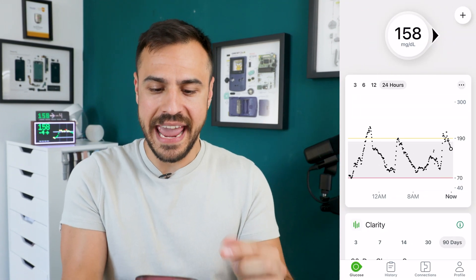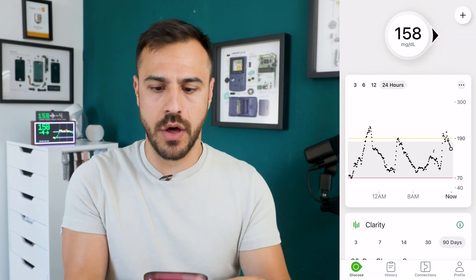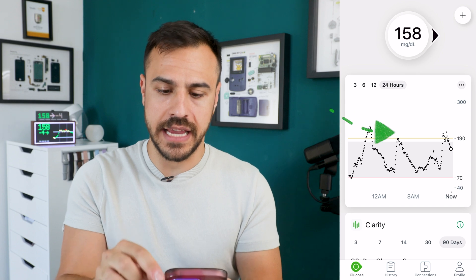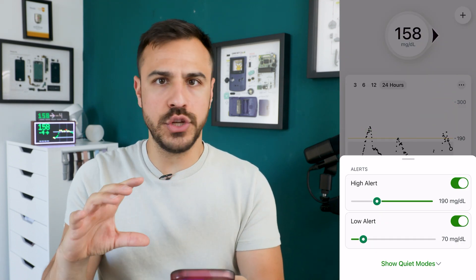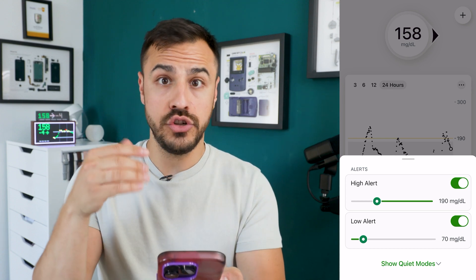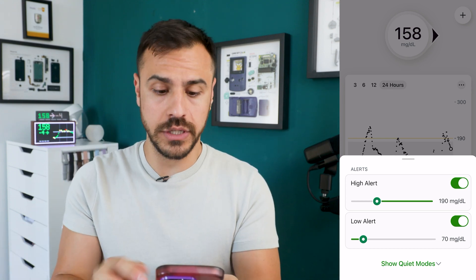I want to start with the first thing you're going to see, which is the home screen. Near the graph of all the readings, there is an ellipsis in the top right corner. Just tap on that, and this gives you instant functions and the ability to alter your high and low alerts.